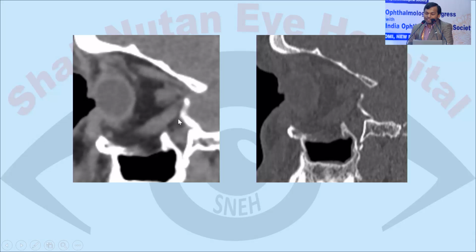In case, like in this case, there is an inadequate bony ledge or there is a fractured bony ledge, then we may have to screw the implant at multiple places anteriorly to keep it in proper position. Here we do have the orbital process of palatine bone intact, which can be used to support the implant.